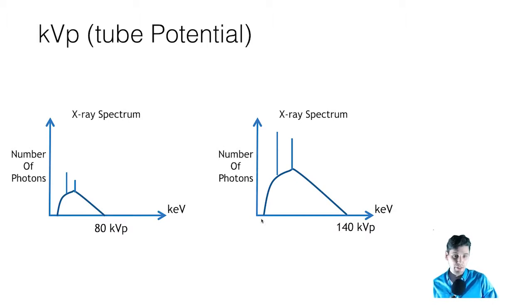The X-ray spectrum is the combination of the Bremsstrahlung, the characteristic interactions, and then the filtration that occurs, the inherent filtration and the filtration along the way before the X-rays exit the window, and then potentially there's pre-patient collimation as well. This is a plot with energy on this axis and the number of photons here. If you change the tube potential, you change the whole look of this X-ray spectrum. This is a plot for 80 kVp, and the units here are energy in keV. The maximum is 80 keV, and that can be achieved because the potential across the tube is 80 kVp.